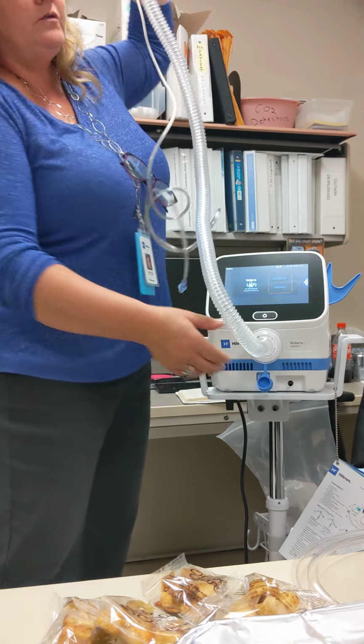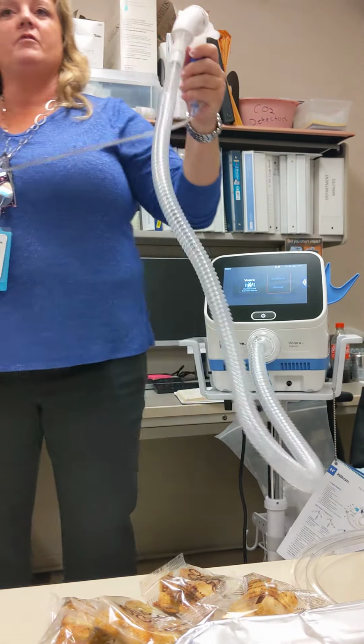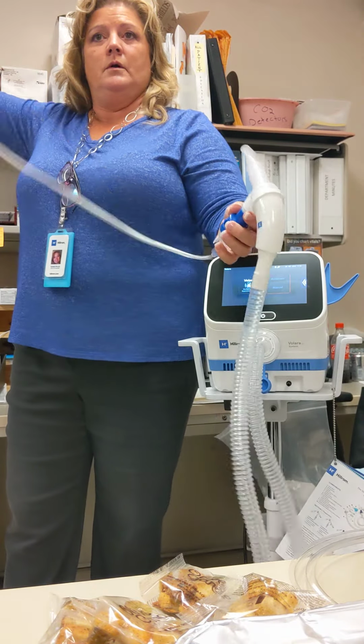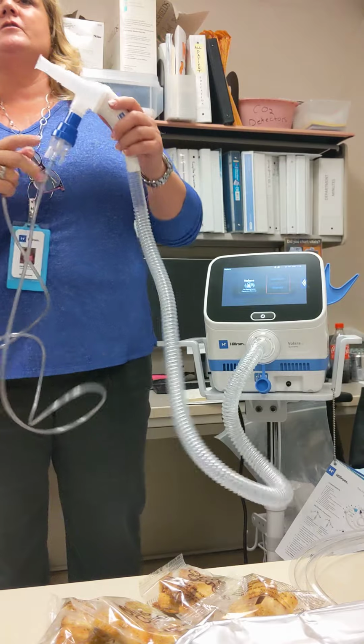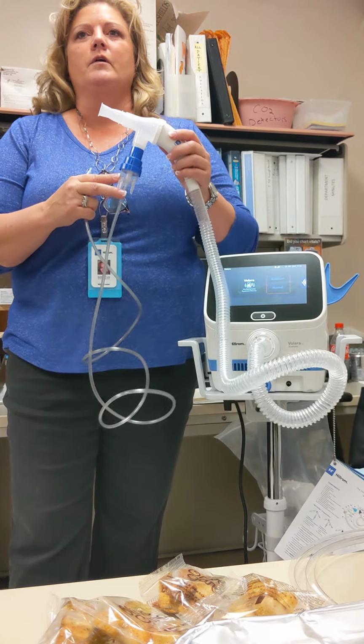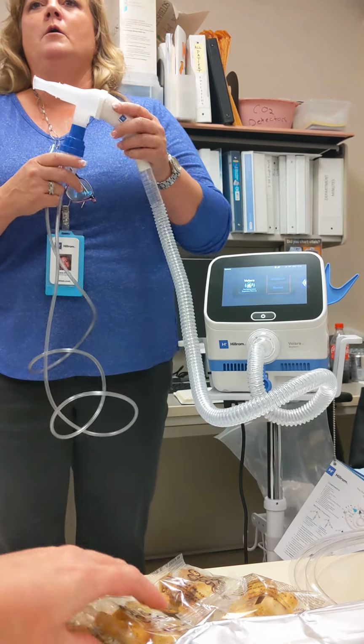About when you do your nebulizer, you go off the wall. You were taught to go off the wall, which is great because you get a little FiO2 extra. But then you'll see that your neb cup would always have residual left over. And why is that? Well, two reasons.